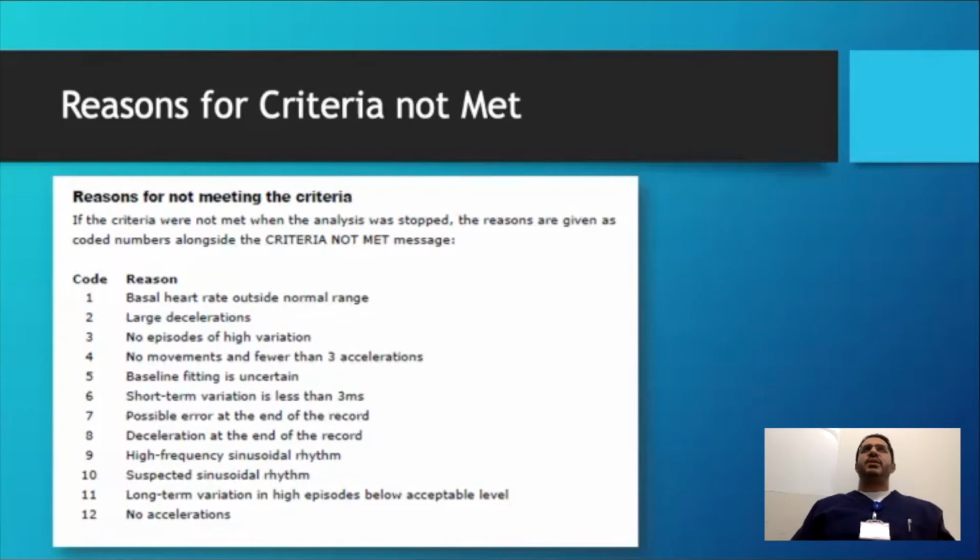The lady that was coming in because she's hypertensive, she's on treatment, we're doing the CTG. Ten minutes of CTG is telling you that this baby is active and responsive. That's good enough. I've got no movements, it's fine. I wasn't actually concerned about the movements, I'm just doing it as an extra check.